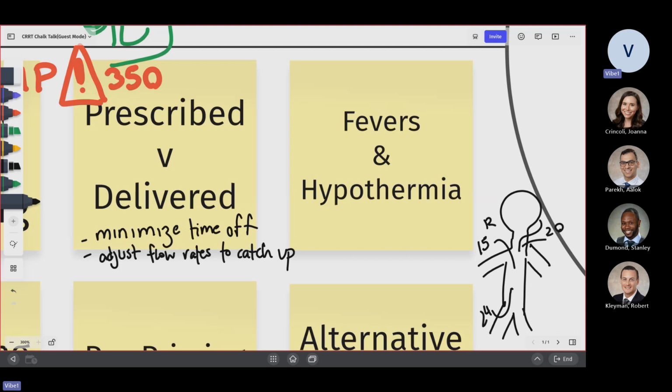I know it's kind of scary when you get the X-ray, because it's not as bendable when you're using the trialysis catheters. You will see that the IJ from the left side will go diagonally instead of the catheter curving along the normal anatomy. But as long as you place it carefully, it works on the left side. And if you're going to go subclavian, make sure you're paying attention to what the BUN is and see if they need a dose of DDAVP. Obviously, that bleeding is going to be difficult to control.